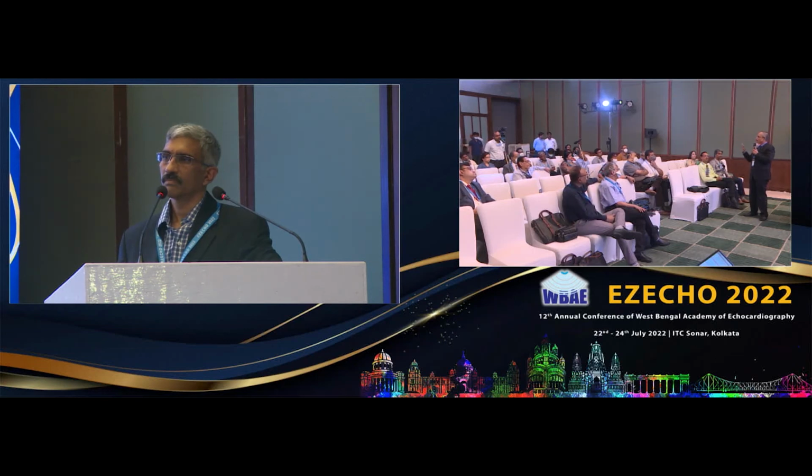And lastly, when the toxicity is advanced, you are going to get replacement fibrosis, which the LGE will tell you. Plus, you have a very reproducible EF in the follow-ups. Plus, with feature tracking, you get a GLS also. So it's actually a very comprehensive examination for cardiotoxicity, but the cost and the access is the major issue. So we have to rely on the ubiquitous availability of echo for EF and GLS.